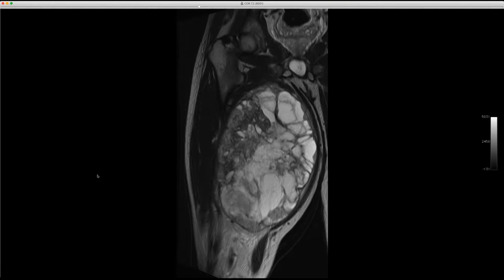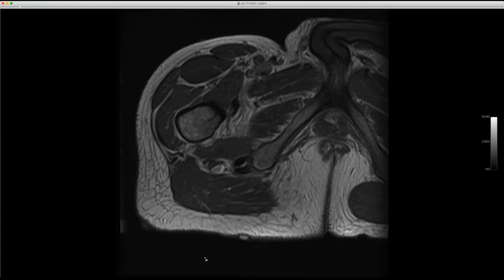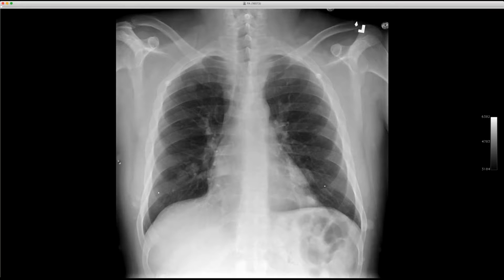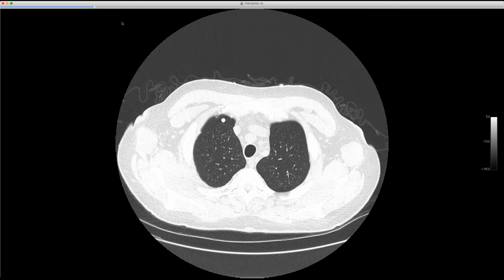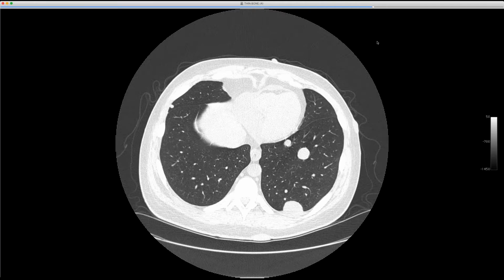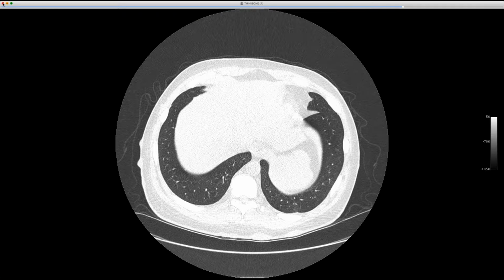And I think on the axial post-contrast, you notice all these skin lesions. See them out in the periphery of it. This thing, really ugly. So if you haven't figured out already, which I presume most of you have, this is metastatic malignant peripheral nerve sheath tumor in a patient with neurofibromatosis. But this is one of the ones where the diagnosis is on the images. Now, I suppose these could be mistaken for neurofibromas, but not all of them have the appearance typical of a skin lesion. And then here's the CT just showing all of these. Typical sarcoma mets, very rounded, well circumscribed.